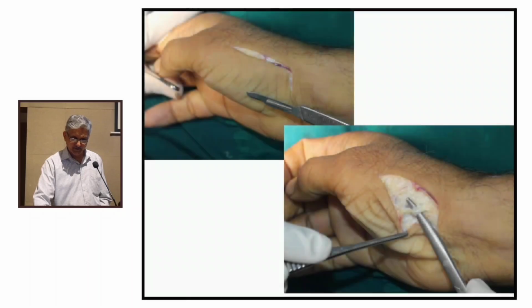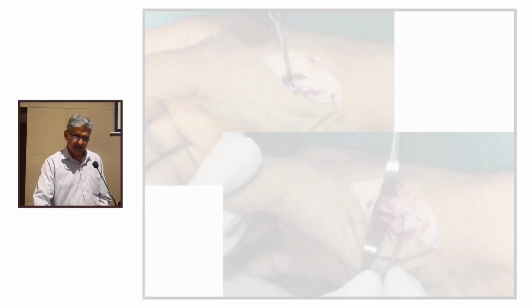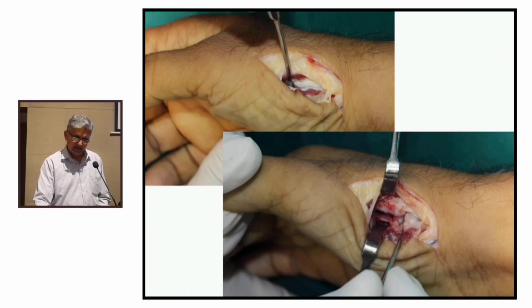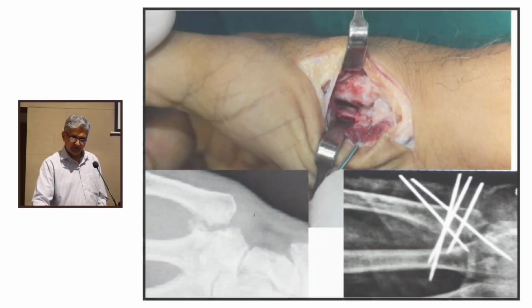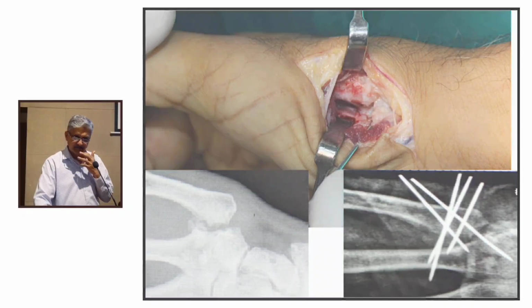So open it dorsally, save the cutaneous nerves, retract the thenar muscles, go on the volar side, and this is the trapezium, this is the first metacarpal, this is the fracture site. Open up this thing, use the fine osteotomes which were described in the morning, 4-6 mm, and push it distally and get that back into alignment, and hopefully you'll be fine.